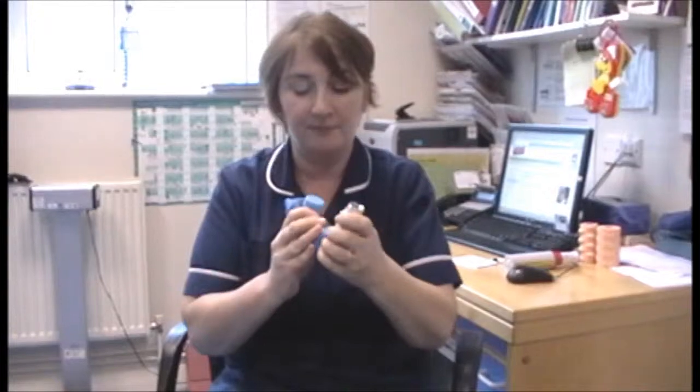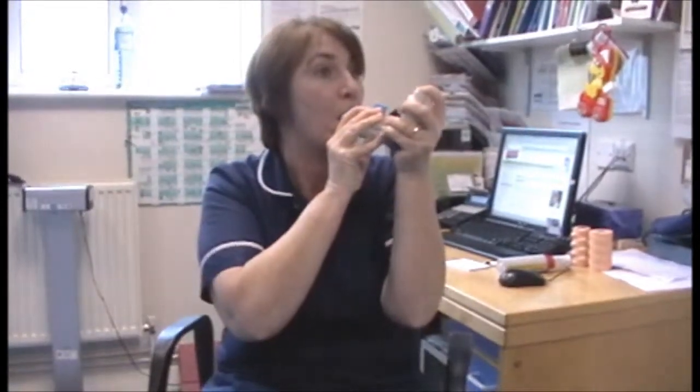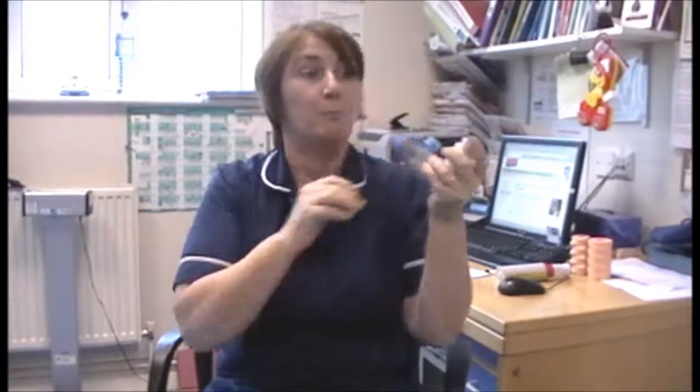We're going to shake it up again, pop it in, and then I'm going to breathe in nice and gently and slowly. I'm going to hold my breath for 10 seconds. And by holding your breath for 10 seconds rather than just suddenly breathing out, it actually helps the medicine reach your lungs.